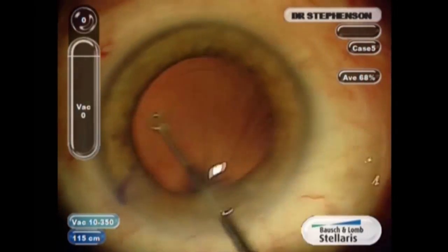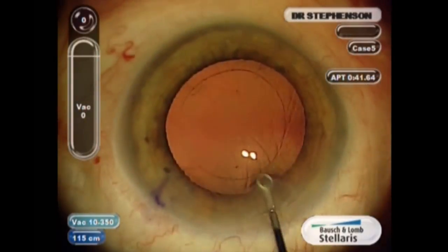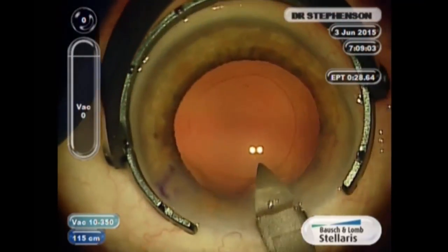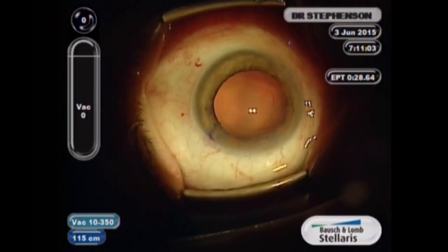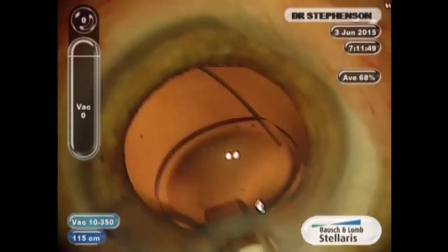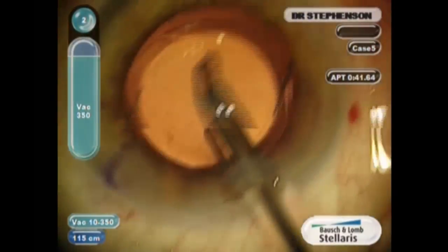The lens I'm going to show you here is the LI-61AO. It's an aspheric lens and your incision has to be enlarged to 2.8. It's an inserter — not an injector — because you can stop it at any time. So I'm opening the wound here to 2.8 with a metal blade. The inserter is really nice because it kind of blossoms and the lens comes out in a planar fashion. I put the leading haptic in the bag and then just rotate it, pronate it, and drop the trailing haptic into the bag and remove the viscoelastic both in front and behind the lens.